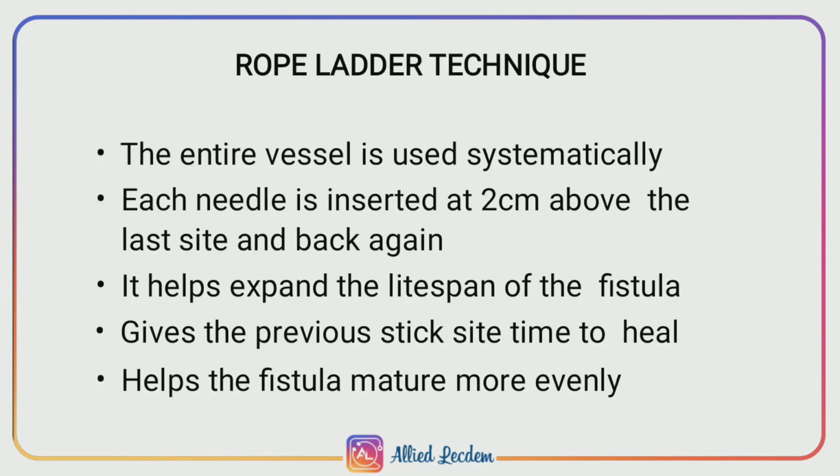Rope and ladder technique: the entire vessel is used systematically. Each needle is inserted 2 cm above the last site and back again. It helps expand the lifespan of the fistula, gives the previous stick site time to heal, and helps the fistula mature and dilate evenly.